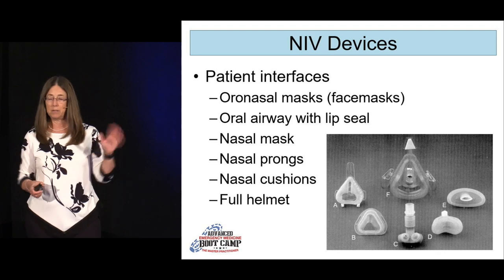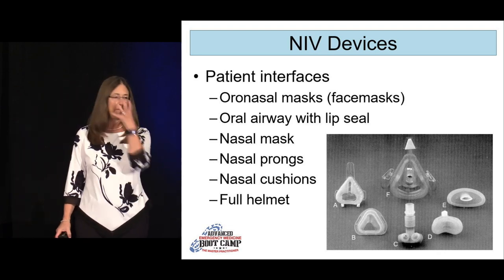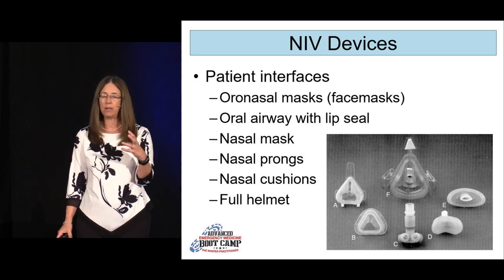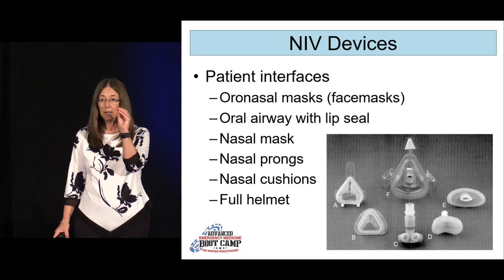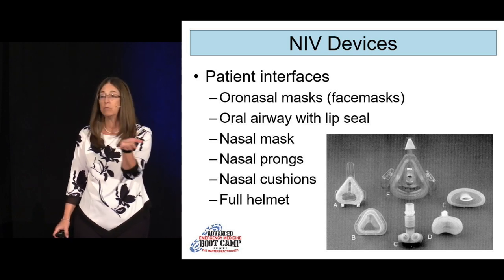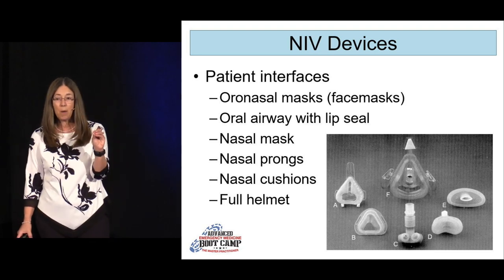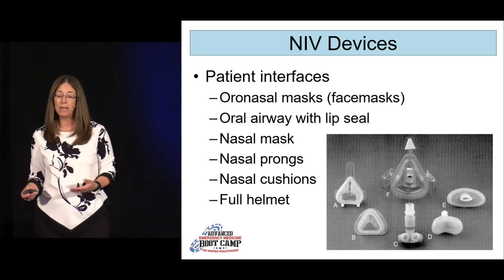We just had a case recently of an acute decompensated heart failure patient who freaked out at the face mask, just totally freaked out. However, when we got her on the nasal mask, she was fine, absolutely fine. We got her to close her mouth. She basically held her own mouth closed, and she was much better that way. So knowing that they all work pretty much equally gives you some latitude on what you choose in any individual patient.